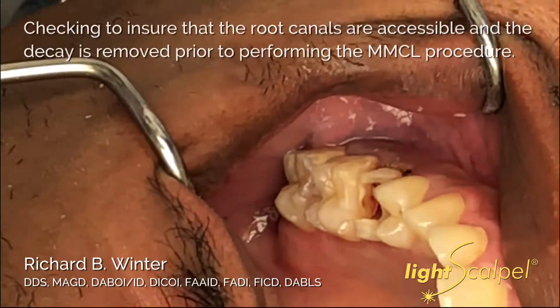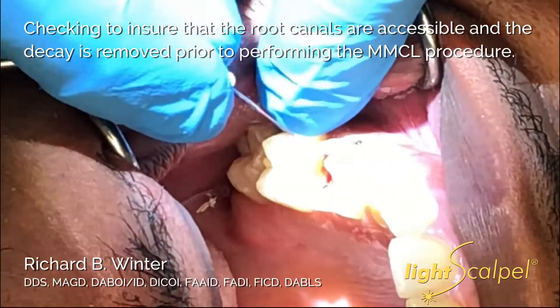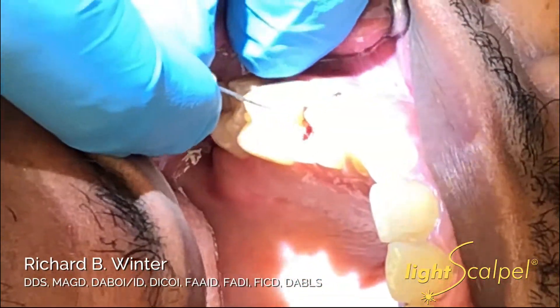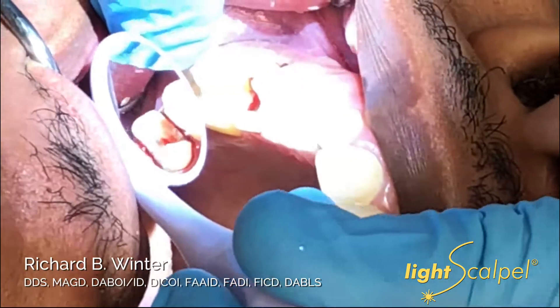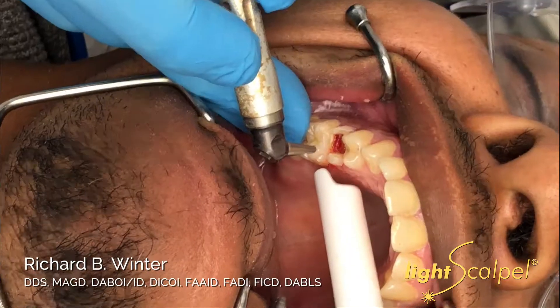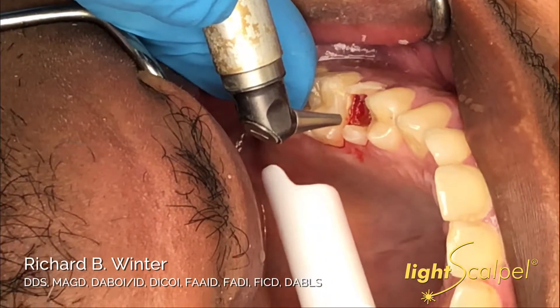Before we excavated the decay, I made sure that we had patency of both the buccal and lingual canal. I used caries detector to remove any and all of the decay to ascertain whether or not there was going to be enough coronal tooth structure in order to save. We have tooth number four here — tooth number four had a carious exposure.